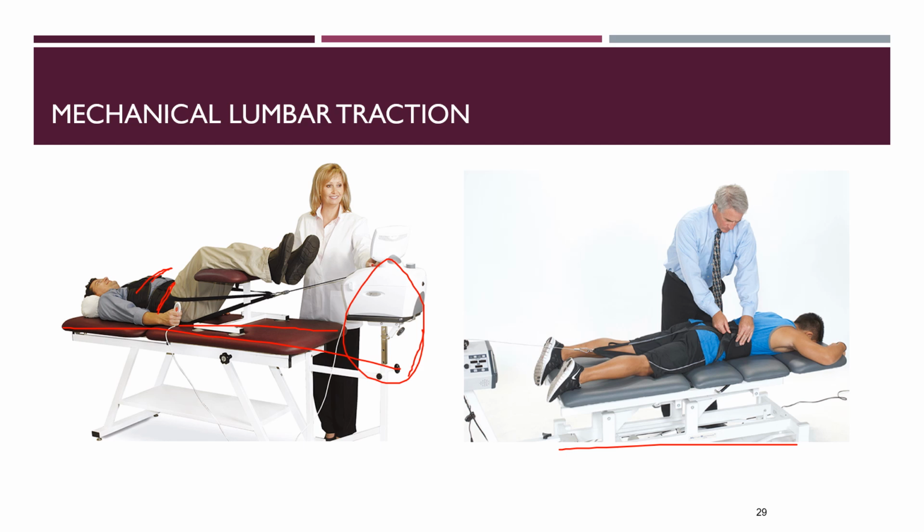So the nucleus pulposus would be traveling this direction here, technically. So it's reducing more anterior, okay? But this would be for a posterior herniation. And the legs are completely straight, so we're thinking this is really low lumbar spine, L5-S1.